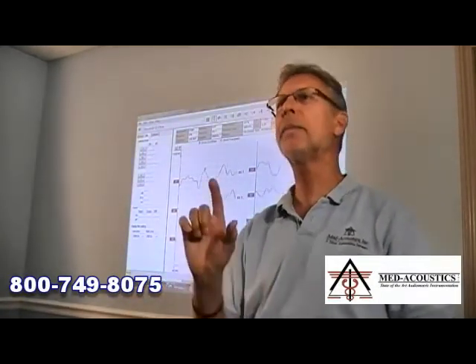So nothing is rejected. There's no artifact rejection. Every sample is taken, but its weight, its contribution to the final average, is dependent on its signal-to-noise ratio.